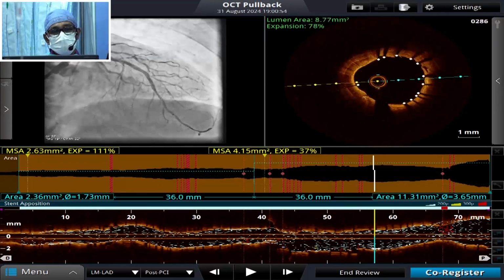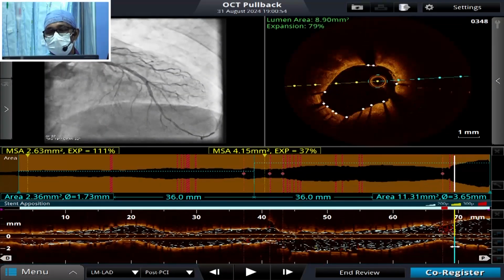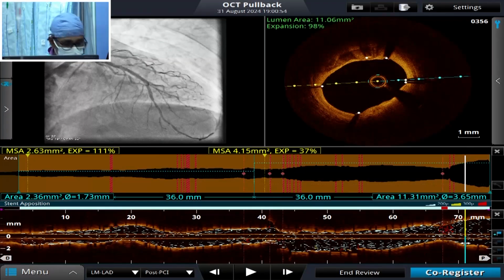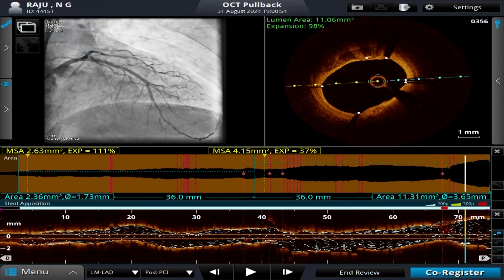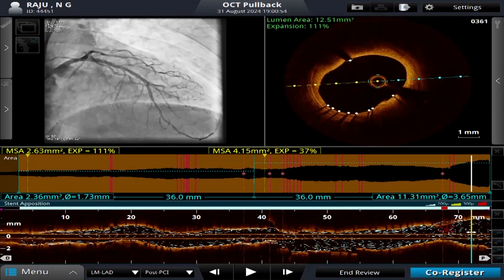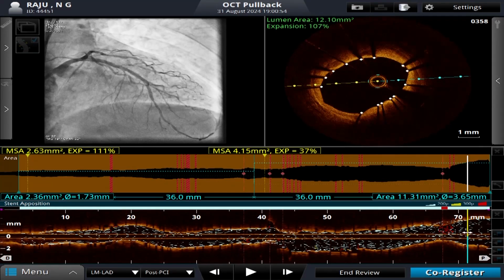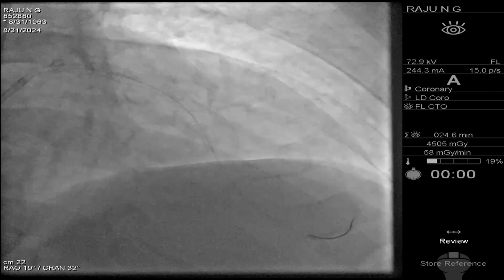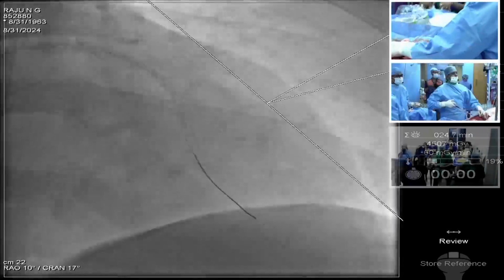But what I thought was the left main confluence was looking small. But if at all we were to dilate it, we have gone at the ostial circumflex at 22, 20, 22 or so. We have gone at the ostial LAD at least 18 to 20. I think probably we'll accept it. Yes, sir. Nitro, we'll take the final shoot. Caudal and cranial.